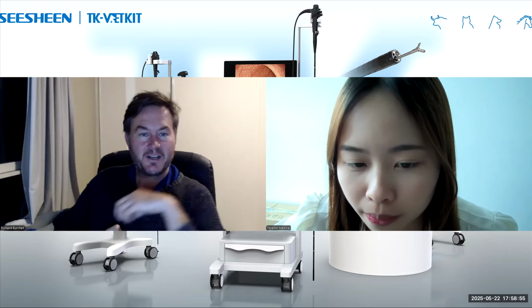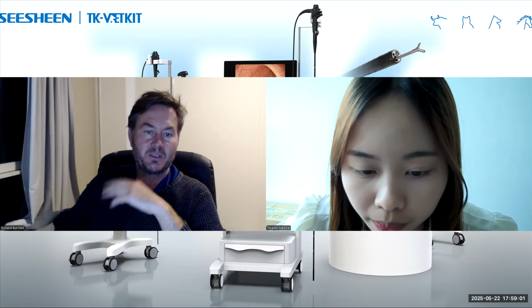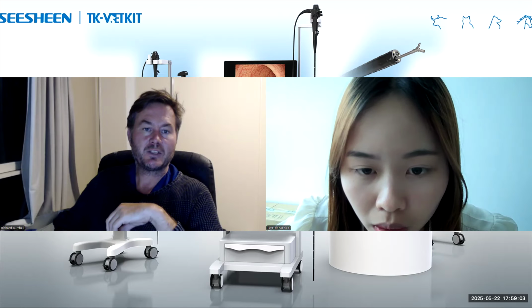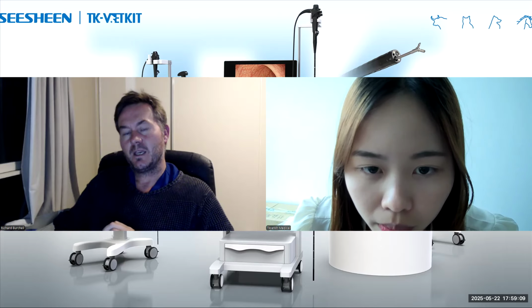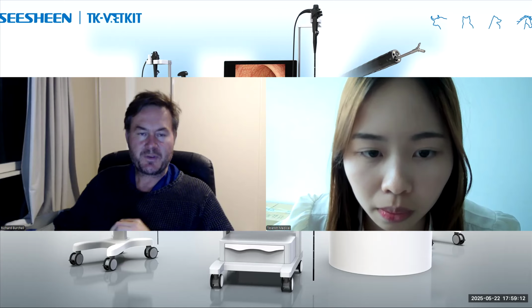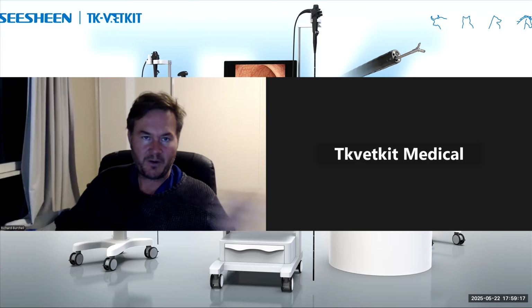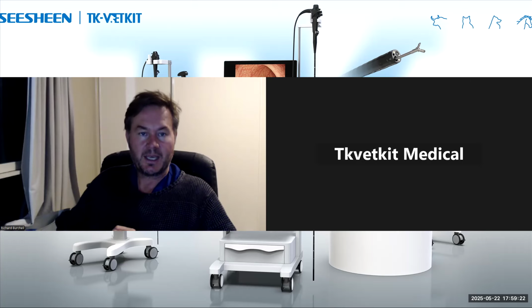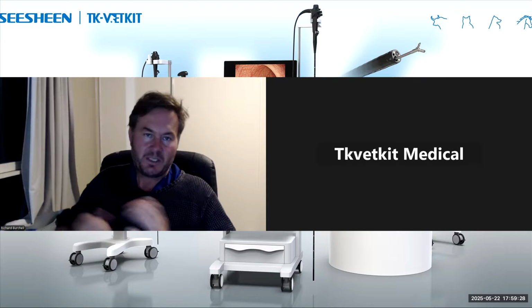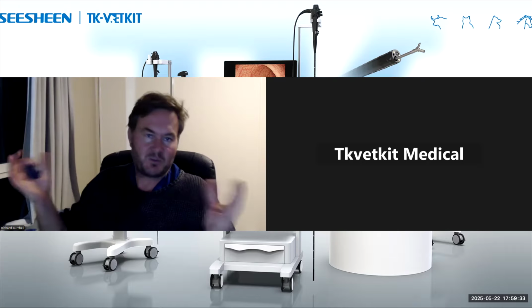Okay. Hello, Tiffany. No, I don't. Maybe for cats, if that's what you meant, then absolutely, terbutaline, but not for dogs. And dental blocks, well, I've done both. I'm generally not the anaesthetist in my area of practice, and I've worked with anaesthetists who are ardent about dental blocks for rhinoscopy. I personally don't find it makes a huge difference. I find it just adds time to the procedure, but that's just my personal opinion.